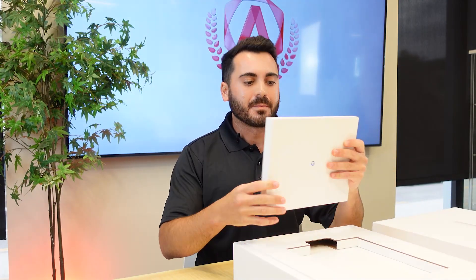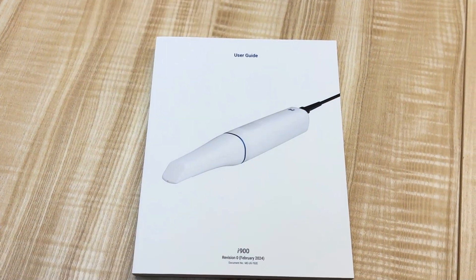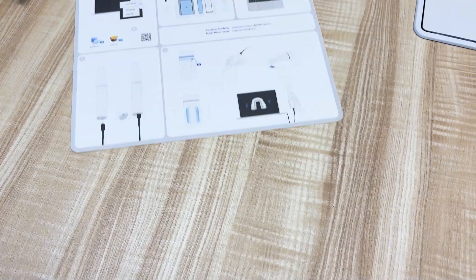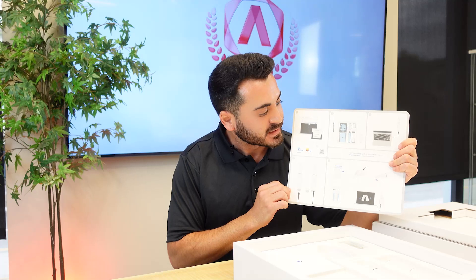At the very top, the first thing we're going to have is our user manual. This is going to have a lot of specific detailed information on the actual scanner itself. Below that, we're going to have a quick start guide with some really nice diagrams to help you get started with the initial setup.